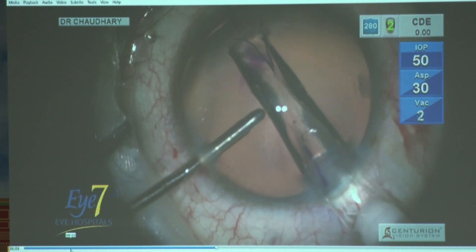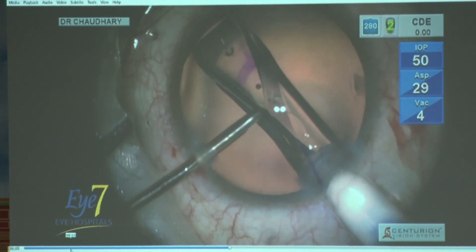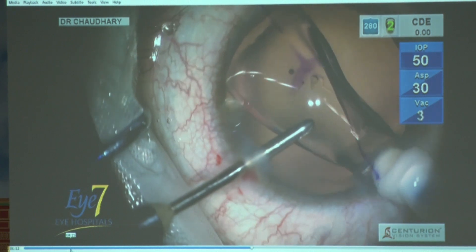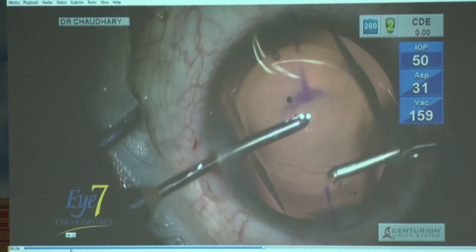Once it is going in, the two ears of the ICL should open up together, and then you open it up in front of the iris and push it all the way along. That's it — the insertion part is simple.